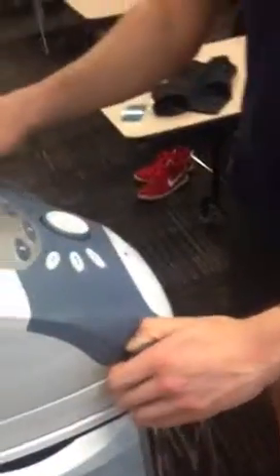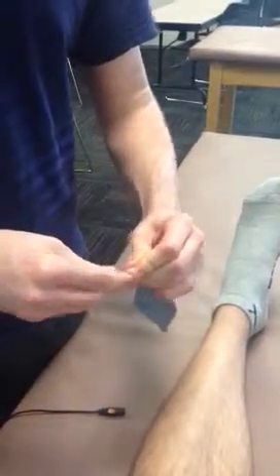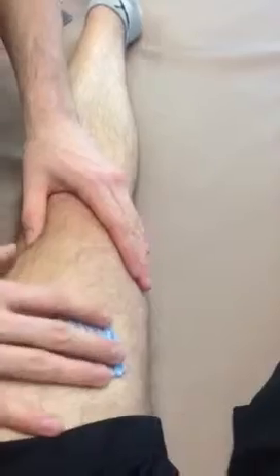So hooking up premod. And make sure that you only have 2. The first one I would hook up is the red one, and the red electrode would be placed closer to the heart. Does that stick well? Yeah. Okay.